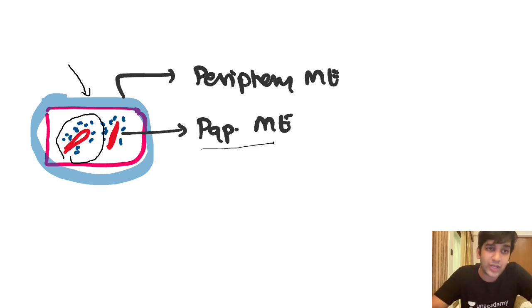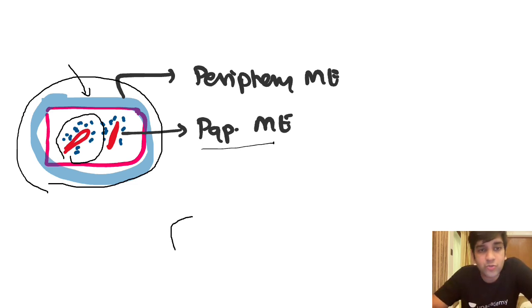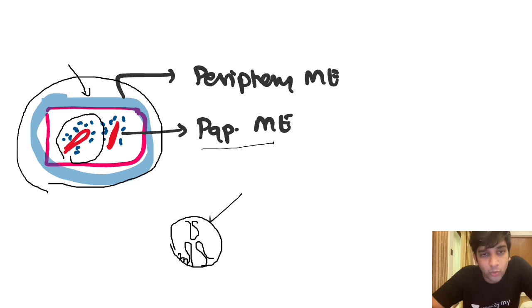Perfect. On the other hand, the outside lesion also, I should look at the myoepithelial layer. See, what's happening here is, let's assume this is a TDLU, a terminal duct lobular unit. Inside this, I have my epithelial cells like this, and this epithelial cell is going to become like a papilla, right? This epithelial cell kind of becomes like a papilla. That's how it grows, right? So what I'm saying is this lobule will have one layer of myoepithelial cells, and also this papilla will have layers of myoepithelial cells. I have to look at both.